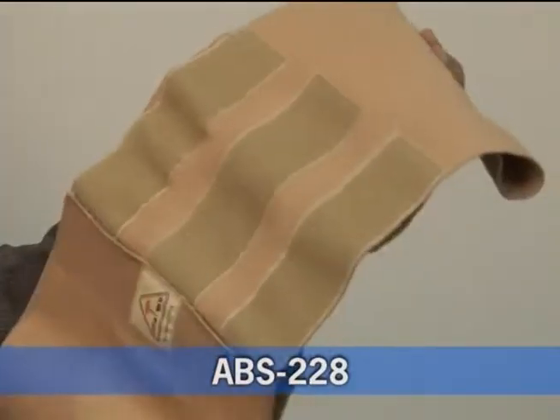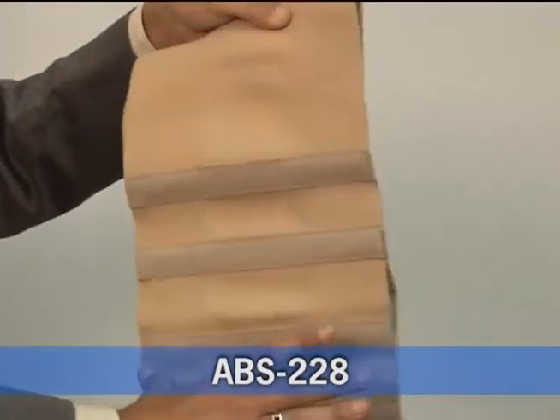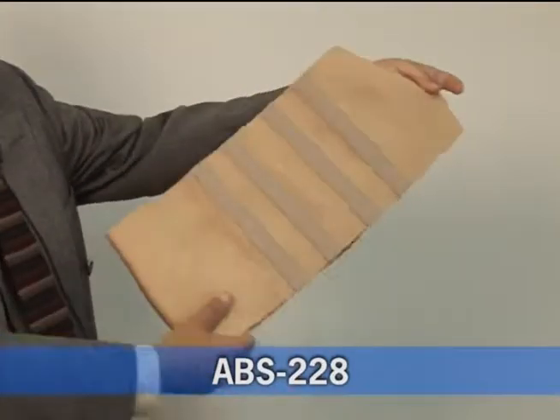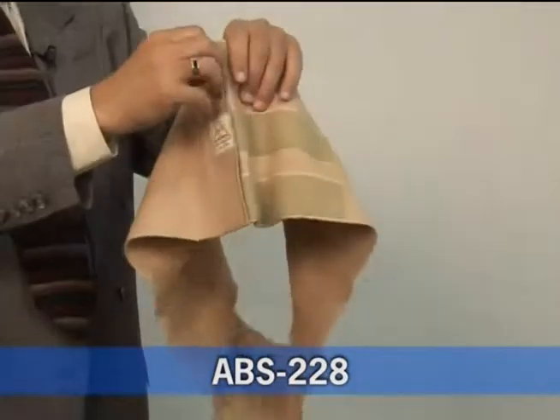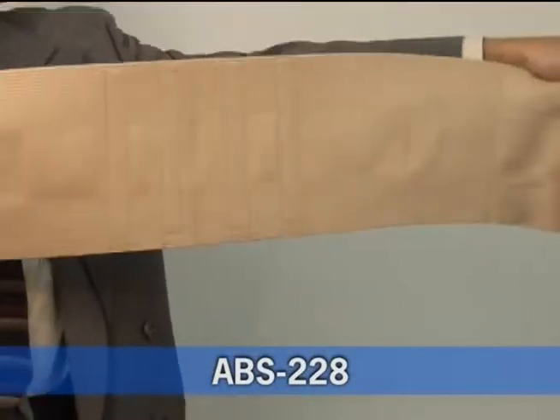This belt provides both abdominal support as well as back support. The front and back of this belt have identical width, which allows for an even and contoured fit. On the back side of the belt, it has four stays. It is very elastic and very durable. It has a single pull, allowing for ease of use.